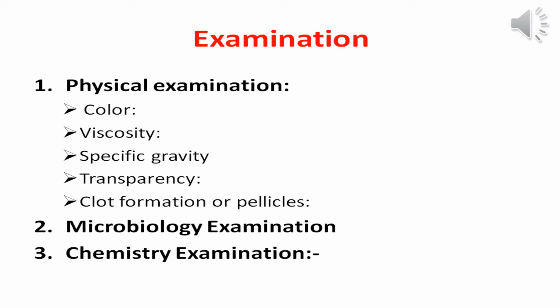Also a Gram stain is very important to perform, because any organism present in the CSF and seen under the microscope by using a Gram stain is significant. Why significant? Because there is no normal flora present in the CSF. So any gram positive or gram negative present in your Gram stain prepared from the CSF sample is significant, and you should report it by telephone to the physician.